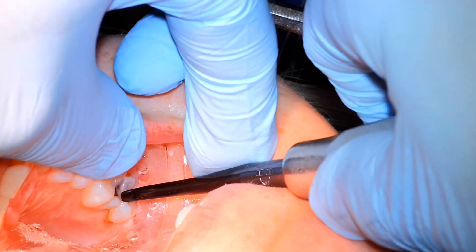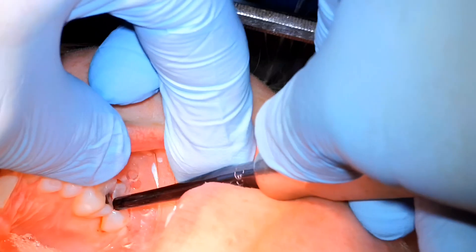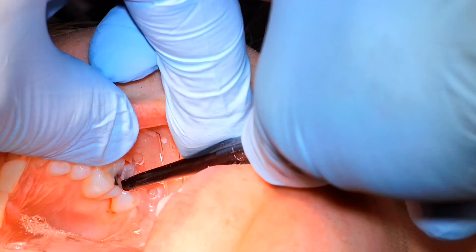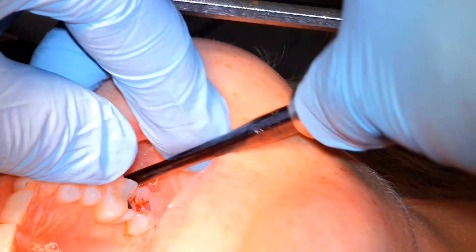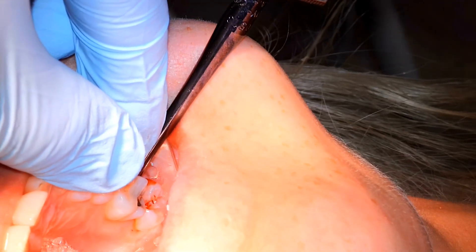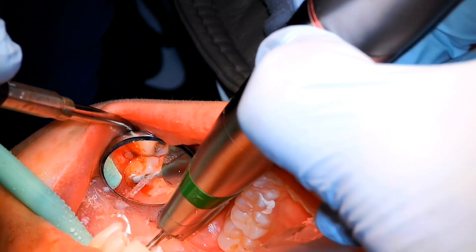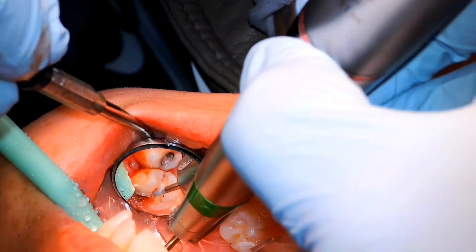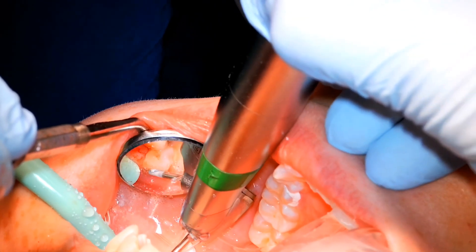We're getting pretty close to depth, so we're going to split the rest with the elevator — just rotating and playing those sides off one another to luxate the two parts. The mesial and distal roots are being luxated together against the palatal root. We're trying to have the elevator seated deeply so we're not applying too much coronal pressure on the tooth structure, as that can fracture away coronal structure. I'm trying to elevate from the mesial just in case it lifts out — it doesn't, so we'll section apart the mesial and distal root. The distal part had some decay, but that's no big deal.